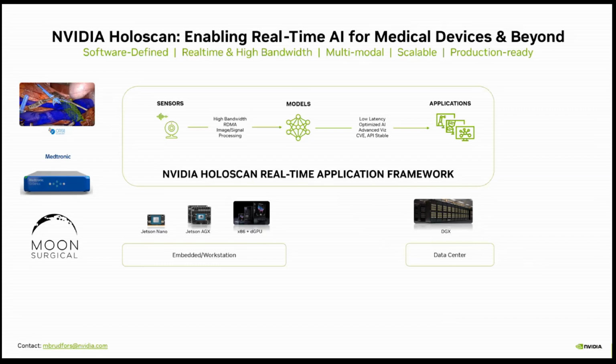This platform runs on various hardware. So Jetson is NVIDIA's embedded product line with the ARM64 instruction set. It runs on x86 workstations with GPUs up to large DGXs, where you might have heard large language models being trained. And interestingly, the applications we previously saw were all developed with the Holoscan platform. So Orsi's work, and just like Mikael said, we collaborate with a lot of academics that do state-of-the-art research.